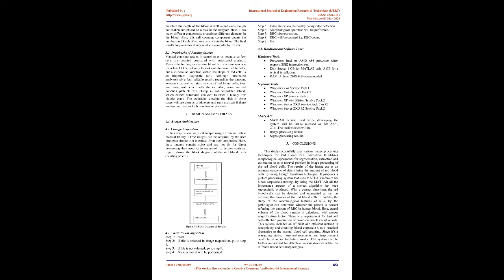4. 3. Research methodology. Counting the cells in a patient's blood was performed manually, by viewing a slide prepared with a sample of the patient's blood under a microscope. Nowadays, this process is usually automated by use of an automatic analyzer. The hemocytometer is a device originally designed for the counting of blood cells.